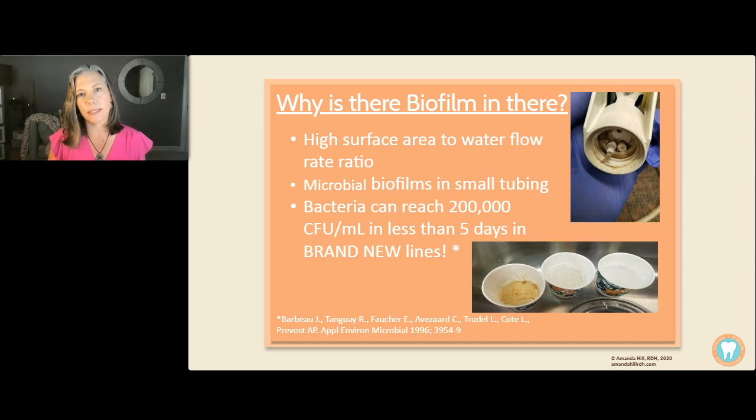The reason I think this study is so important is because as a hygienist, or as a lecturer on water, a lot of people say, well, my office is pretty new. I don't think we really need to worry about this yet. And you know what? I don't even care if your office is a day old. You're already growing biofilm. So it's really important that we pay attention to that. You can see these nice, gross pictures down here in the lower right-hand corner, the funny brown stuff. Once upon a time, that stuff would come out of my lines, and I didn't know what it was. I was like, oh, there must have been something in the line. And now I know that was biofilm. Whoops, I could be making people sick.